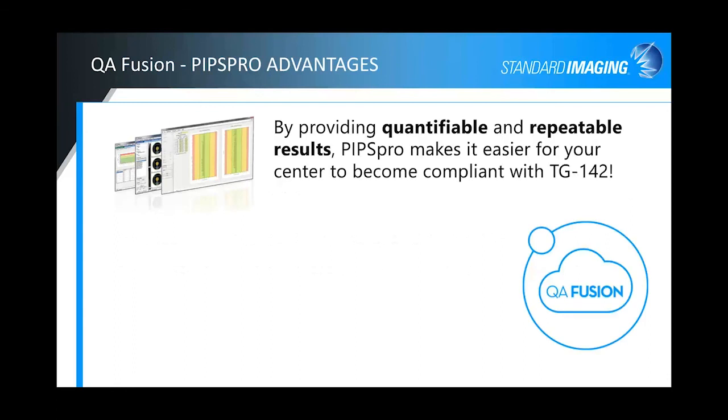Quick advantages: very quantifiable and reproducible results within PIPSpro. It makes it very easy for you to become compliant with TG 142 recommendations for those accreditations. And a centralized database, scalable to specific needs.